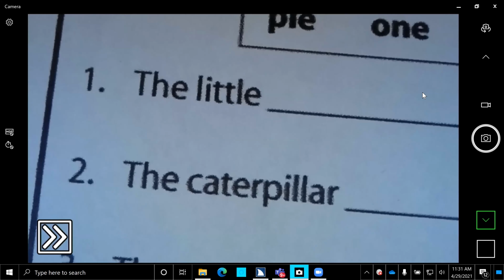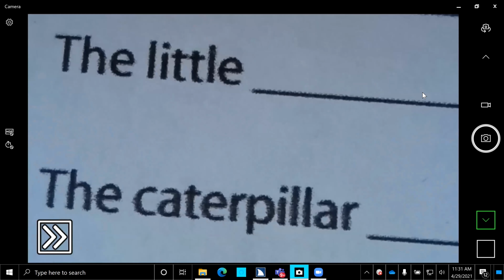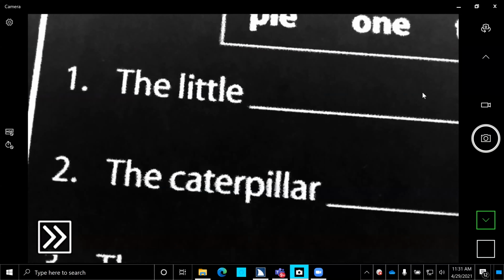True full color is that. So that's what the true full color looks like. And I can zoom in or zoom out just by pinching and zooming. I prefer, just because it's the only way I can see anything, toggling to the white on black.